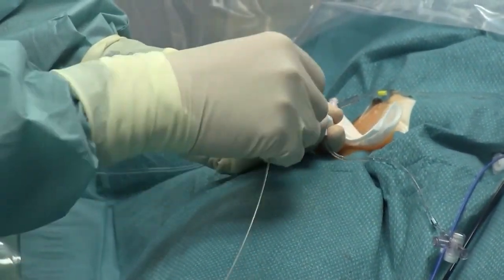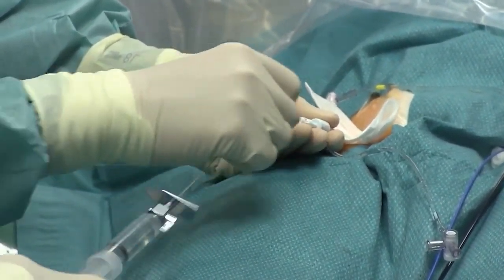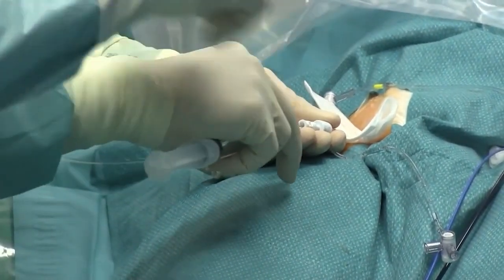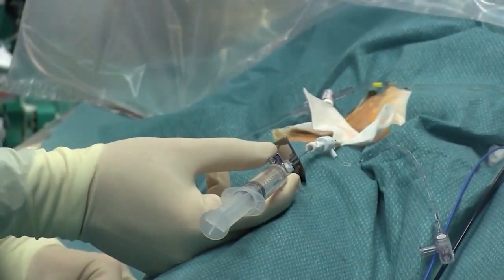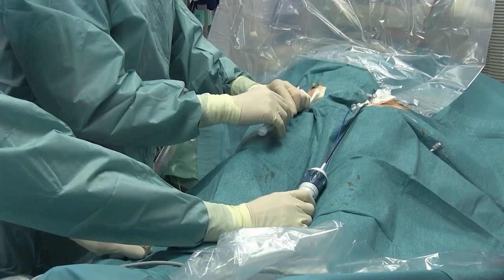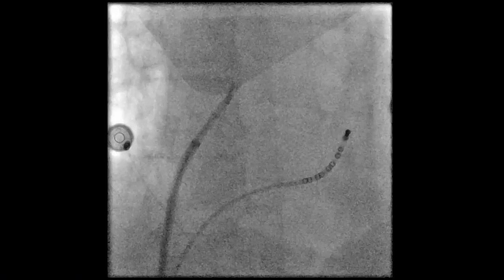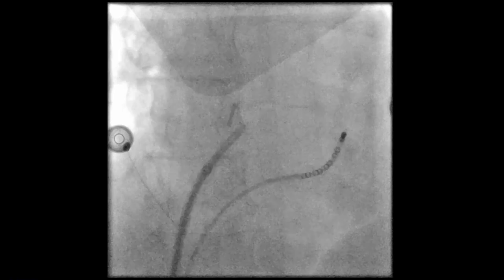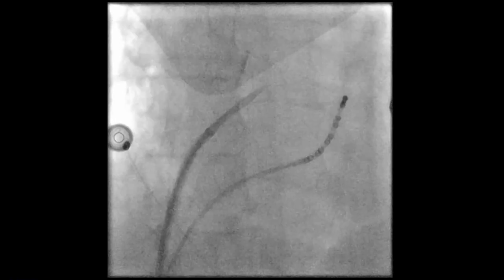The needle is then inserted into the dilator, and distance of about 2 fingers width is maintained between the hub of the needle and the sheath. The hub of the needle should point into the direction of 4 to 5 o'clock position. Then the whole assembly is put back under fluoroscopy into fossa ovalis. The correct position of the tip of the sheath is confirmed on ICE.